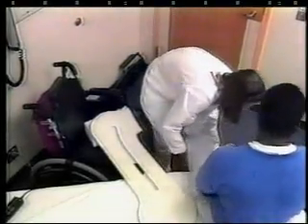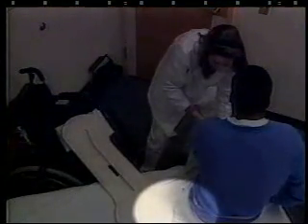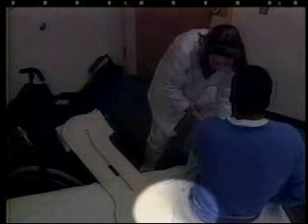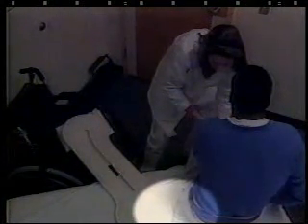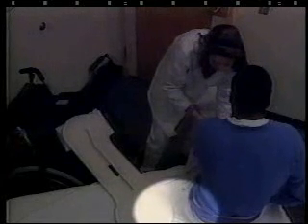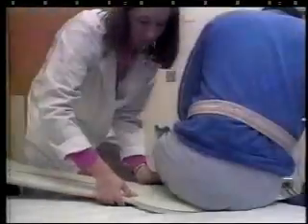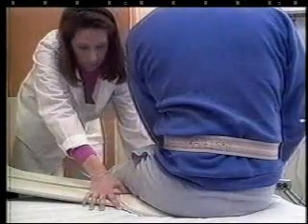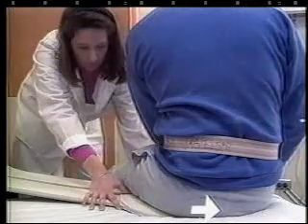Place the seat under the patient by lifting the patient's lead leg over the other leg. Ask the patient, or help him or her, to lean as far as possible to the side opposite the transfer, lifting the buttocks as much as we can to make room for the Beasy seat, so that it cannot move. Note that the patient is seated slightly to the rear of the seat. As stated before, this is important for maximizing the ease of the transfer.